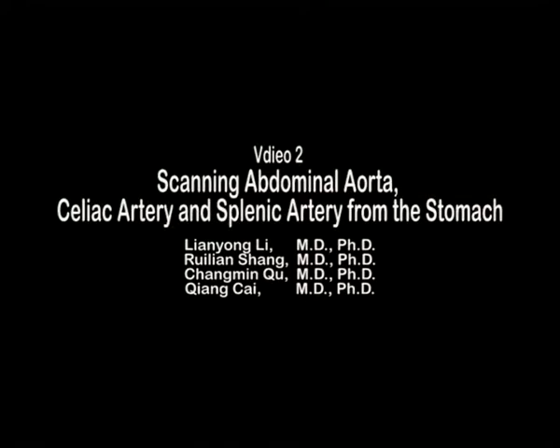Video 2. Scanning abdominal aorta, celiac artery, and splenic artery from the stomach. This video demonstrated how to image the aorta, the celiac artery and its major branches, and the splenic vessels with the transducer while scanning from the stomach.